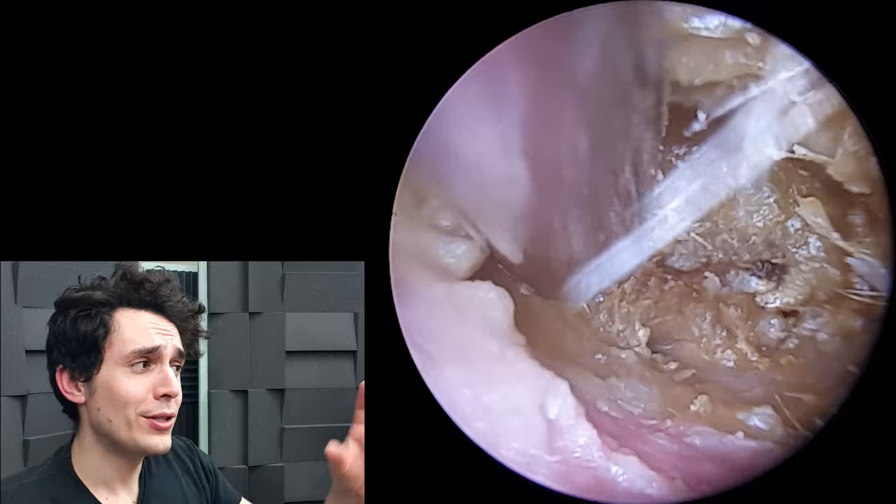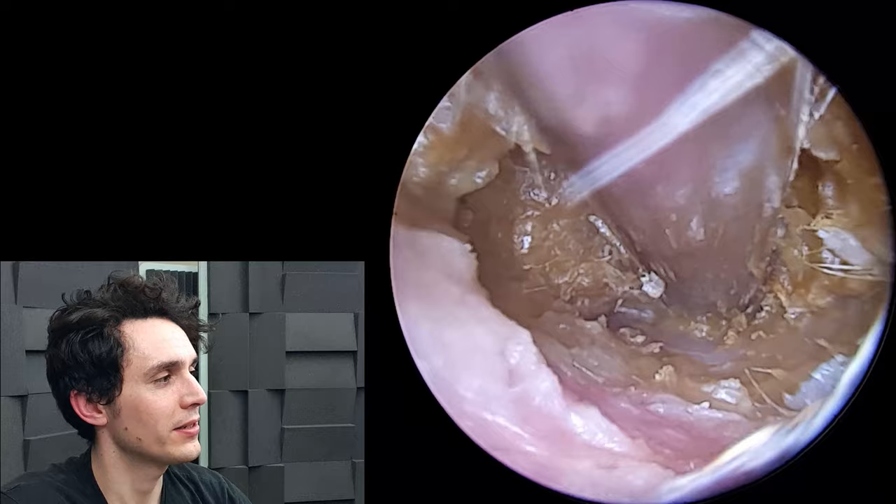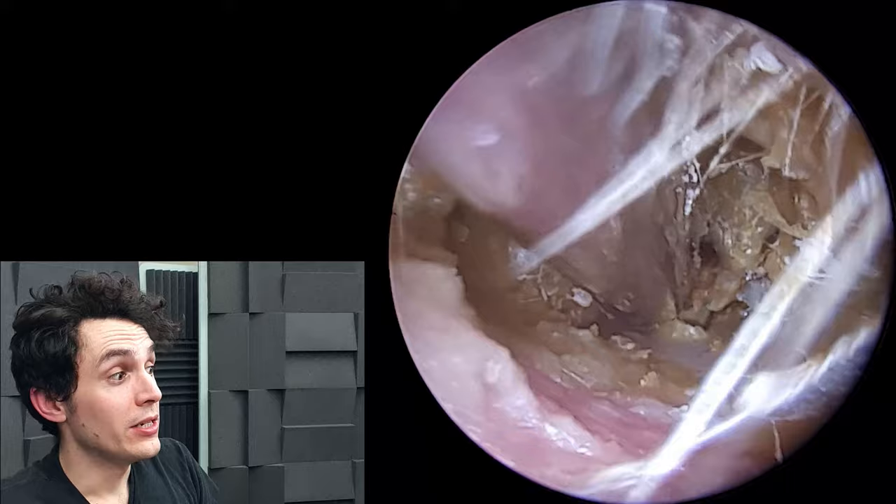because it's not quite soft enough that we can just latch onto it and draw it out, but it's not hard enough to hook it out all in one big chunk. So it's the type of wax we'll really have to work on and be patient with.